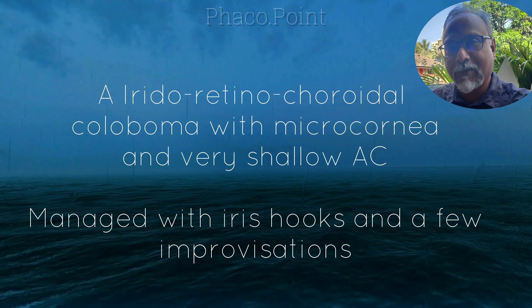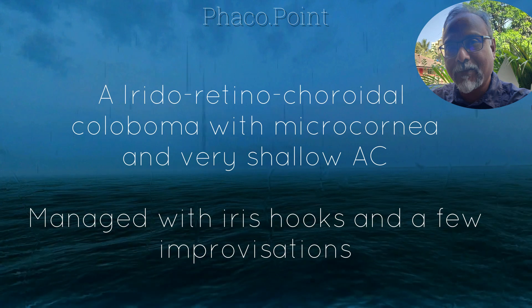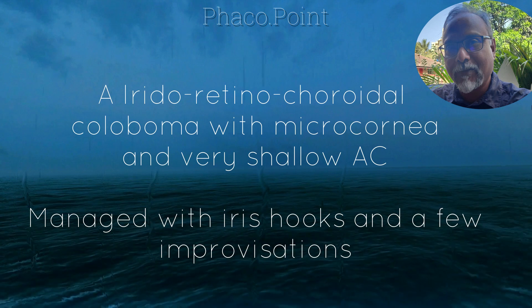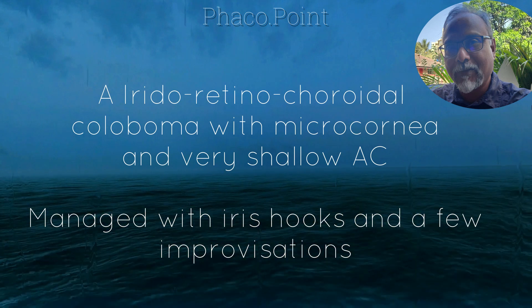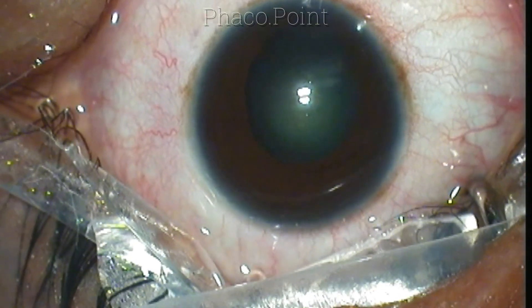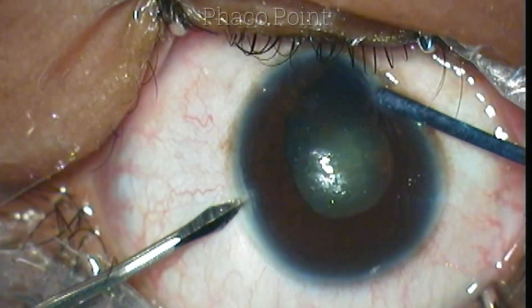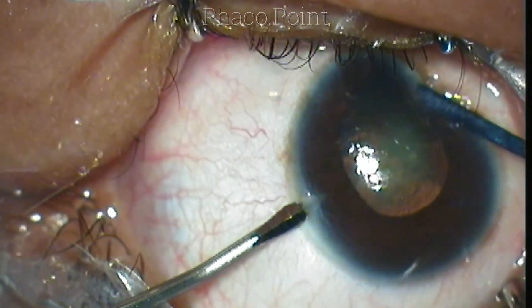Hello friends. Today I'd like to present a case of iridoretinochoroidal coloboma with a microcornea. The corneal diameter was less than 10 mm, with a very shallow anterior chamber and a bulging lens surface. This was a 30-year-old female patient who presented with diminished vision as a result of a progressive nucleosclerotic cataract.